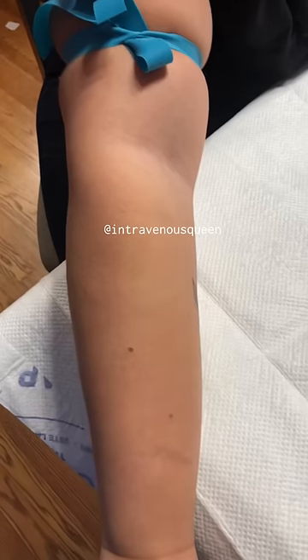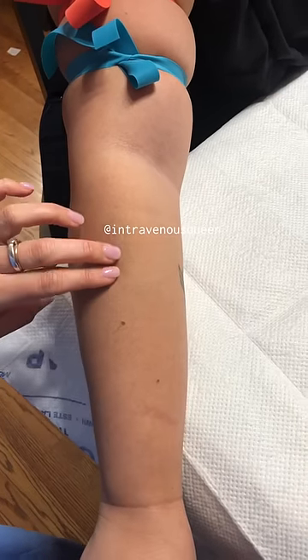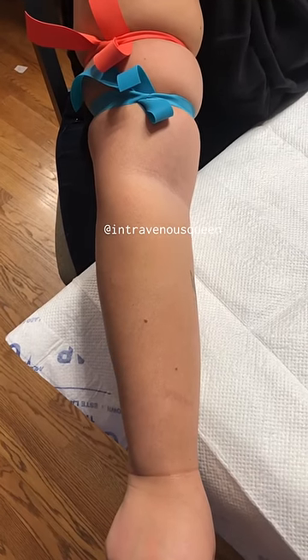Once I find the vein that I'm going to go for, I place myself directly aligned with the vein. Finally, it's time to place my gloves on.